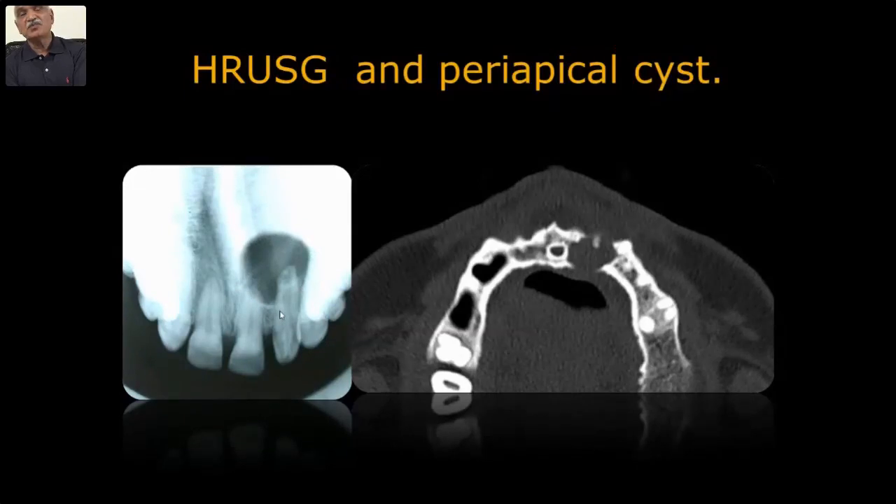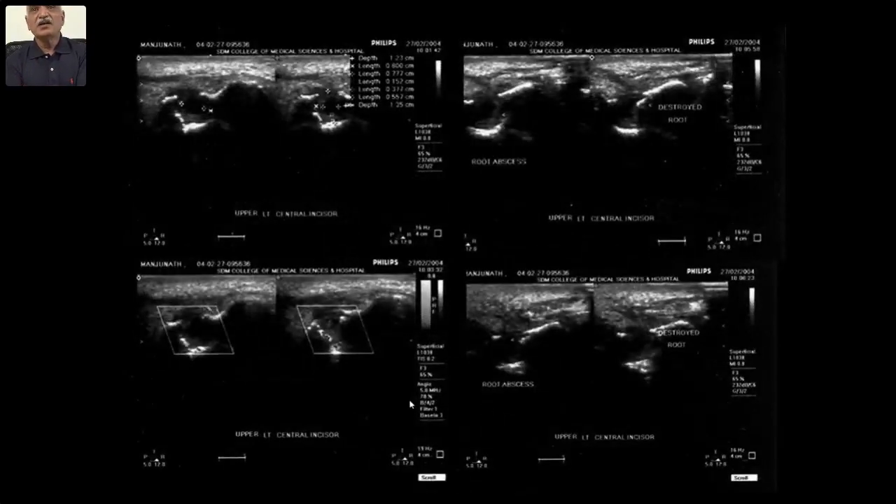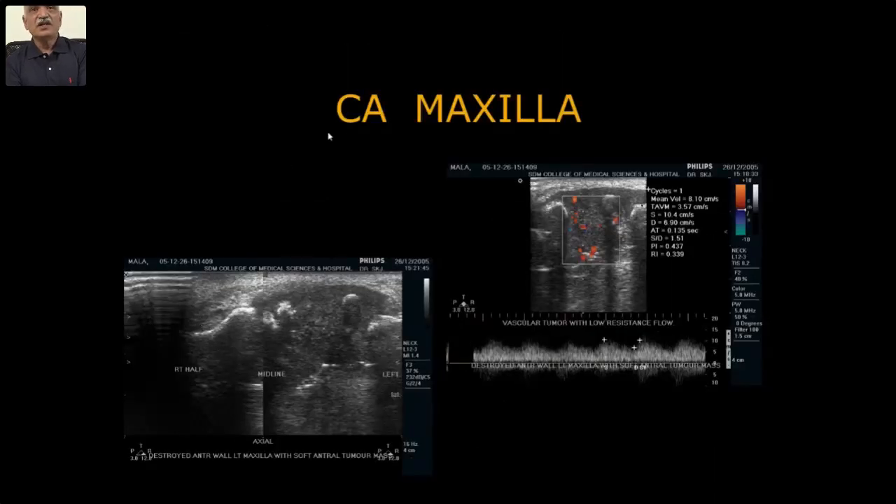When the radicular cyst is more than 4 millimeters, you get a window through which ultrasound can see whether the contents are fluid or have some amount of granulation tissue. Somewhat of granulation tissue indicates it may be allowed to heal — they may not enucleate it completely. This might help them decide: in one case they must take a flap, in another they need not. These are various cases of radicular cysts where ultrasound has a role.